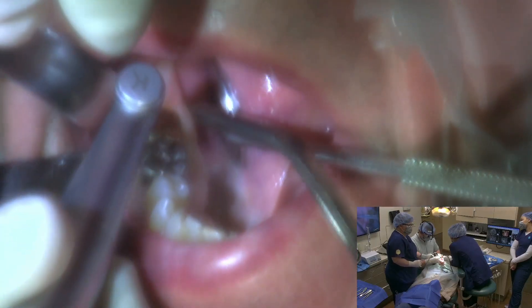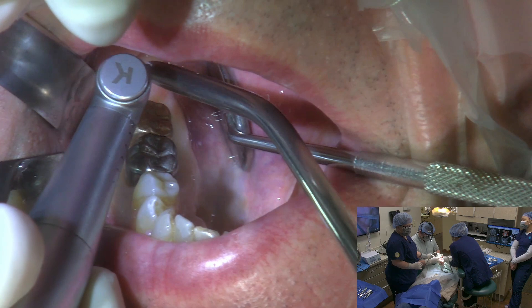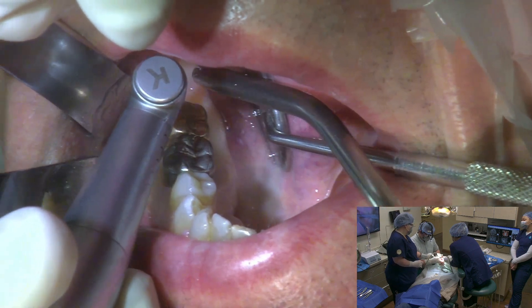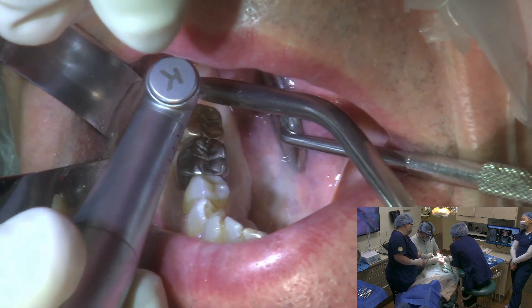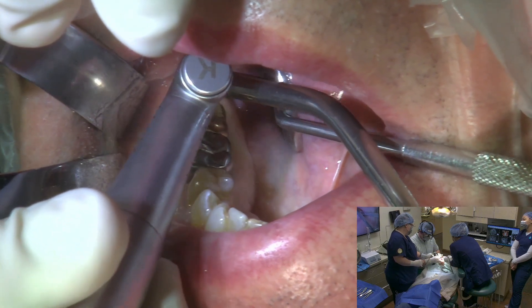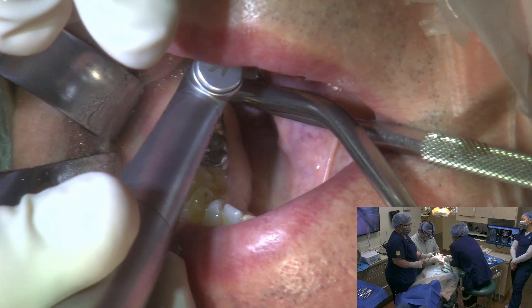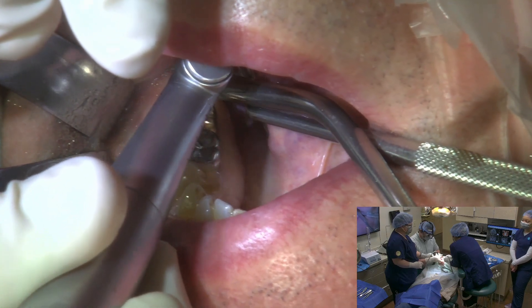I'm going to video tape this so you'll hear me talking. We're just going to go ahead and section the tooth. There's a lot of noise going through the crown. If you feel anything, we've got our eyes on you and we'll make sure that we stop.